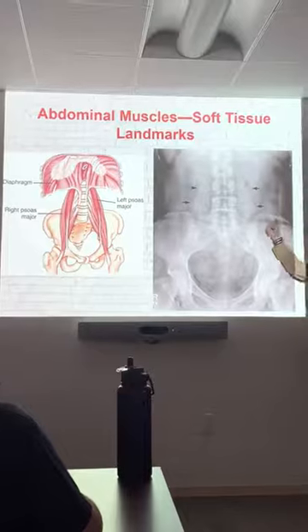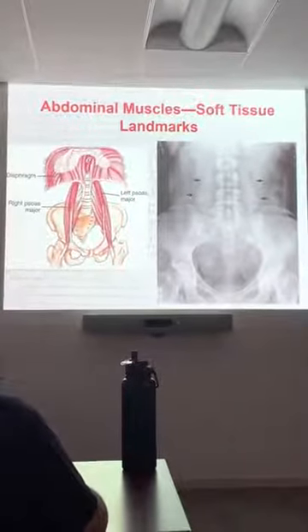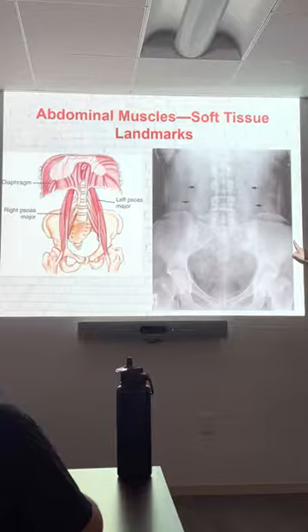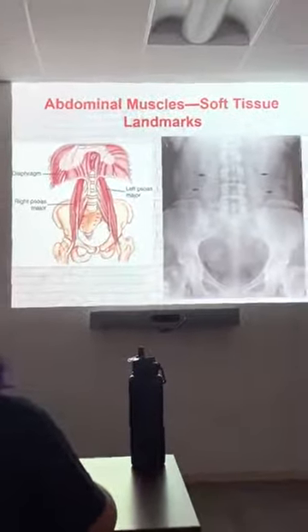Case in point, the iliac crest. Y'all heard us talk about the iliac crest? That's our major palpation landmark for KUB, so we make sure that we center to the belly properly. The iliac crest is the top portion of the pelvis. Not down here, by the way, that's something different. This portion right here, the very top. That's going to be important when we palpate that we do that correctly.